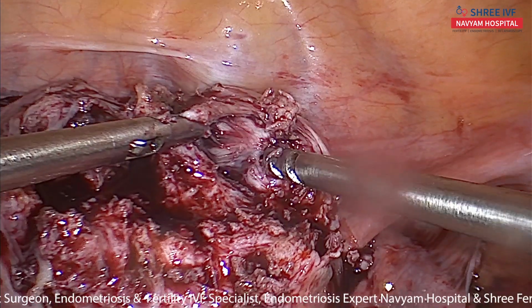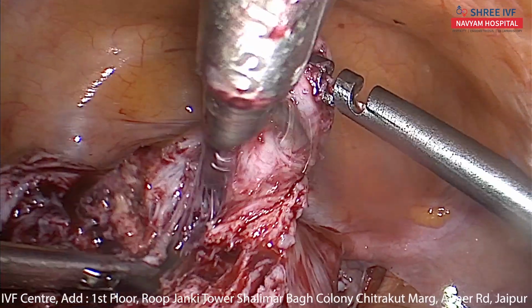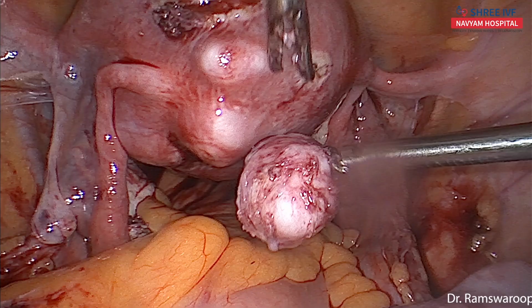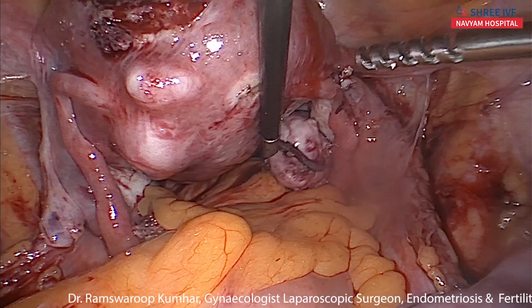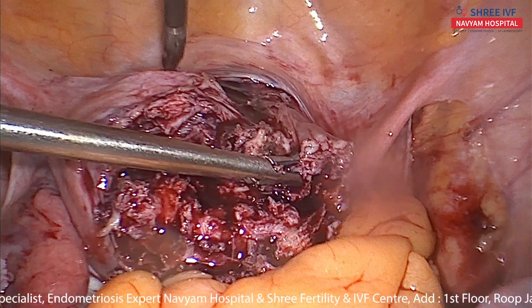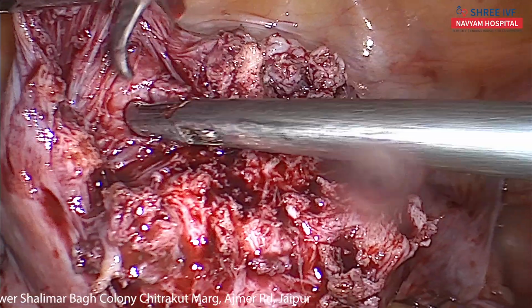First, this is the traction and counter traction. This is myoma number 5. Now, let's see further if there is any myoma. This is another myoma, and we will try to remove it from this same incision.